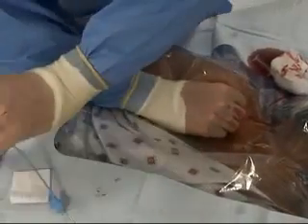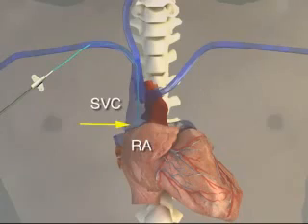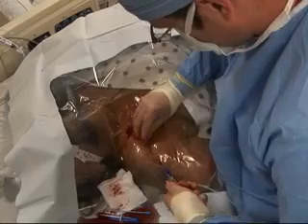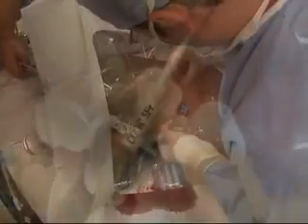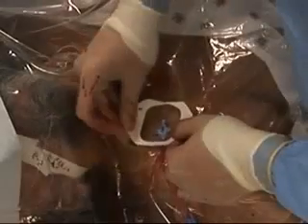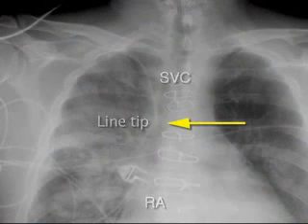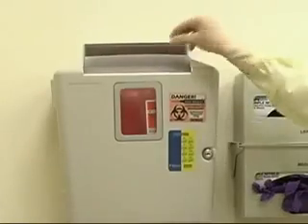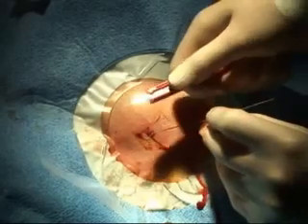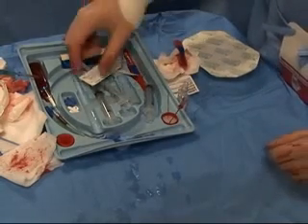If resistance is met, the track may not have been adequately dilated; remove the catheter and try again to insert the dilator. Insert the catheter to a depth that places the tip at the junction of the superior vena cava and the right atrium. Remove the guide wire and check for blood return in all ports. Flush all ports, place caps on the hubs, and secure the line in place. Apply a sterile dressing before removing the drape. Obtain a chest x-ray to assess for proper placement and to assure that no hemothorax or pneumothorax has occurred. All sharps should be properly disposed in approved sharps containers. Scalpels should be retracted into their protective sleeves. Needle stick injury can be minimized by using needle lock devices found in most commercial central line kits.